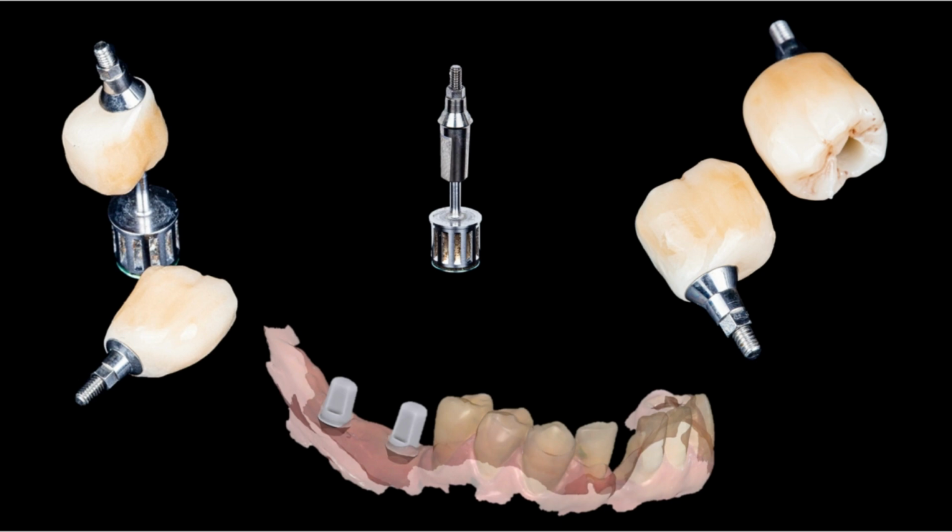In the digital direct technique, a deep subgingival margin can be easily captured thanks to the alignment of the extraoral abutment scan with the intraoral scan. Note here how the margins fit perfectly. Contrary to the direct conventional technique, in which subgingival margins of your abutment cannot be captured well, and so the marginal fit of your final crown will not be acceptable.